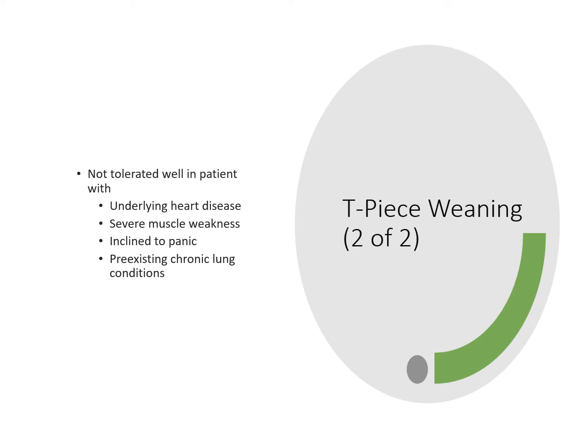When they looked at studies, and this is where I start talking about more studies, yay! Studies comparing SIMV weaning, pressure support weaning, T-piece weaning have a lot of conflicting results. You're like, that's not the news I wanted to hear, that all three major ones out there are conflicting. Each mode of weaning really offers particular benefits to certain patients. So if one procedure does not work well for a patient, try another, right? Ventilator weaning is best accomplished when the expert staff members are willing to be cooperative and find alternate ways to get these patients off.